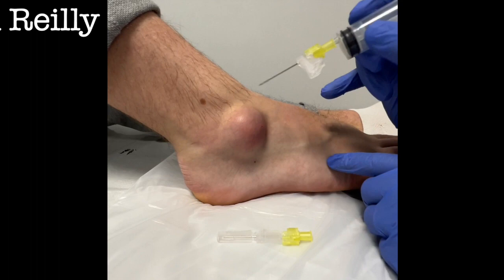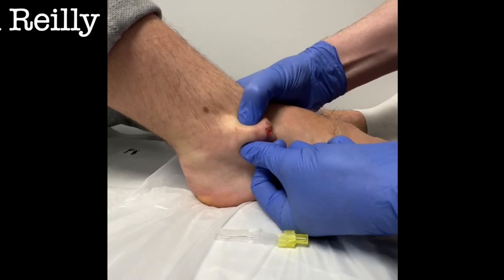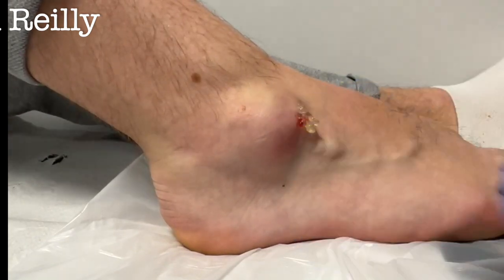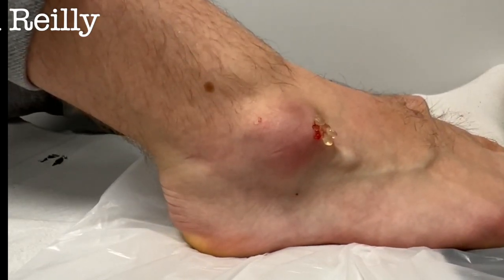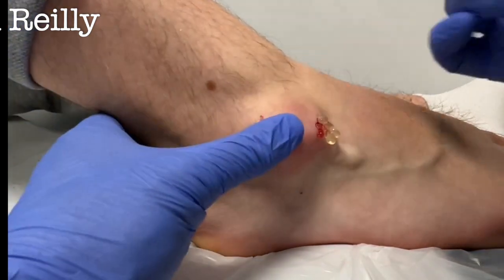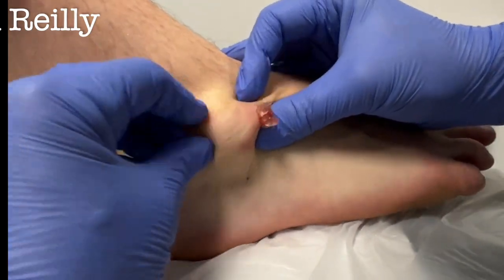I'm going to do one or two more stabs. So now let's see what we can get off this. It's coming — it's coming. I need to make a slightly bigger nick in that. It's a really viscous one. How are you doing? Feeling good? Pretty small but that was okay. Are you NHS or private? NHS — so it's only the private ones we have to worry about. I'm going to do a tiny, tiny little nick. There you go. Still not wanting it — there you go, that's better. It's a toughie.